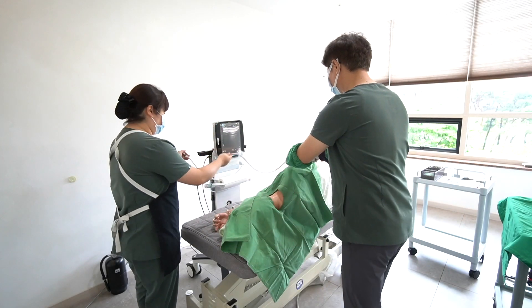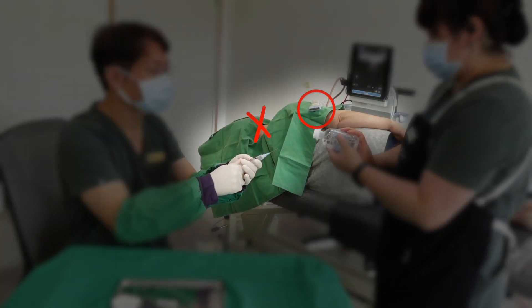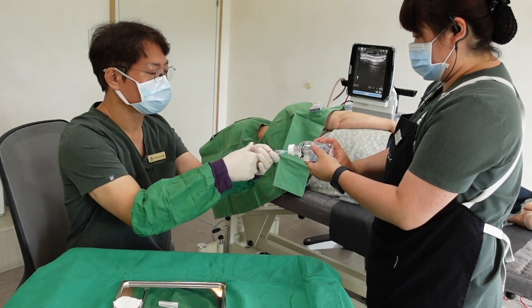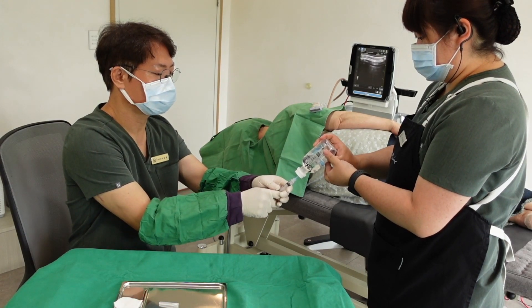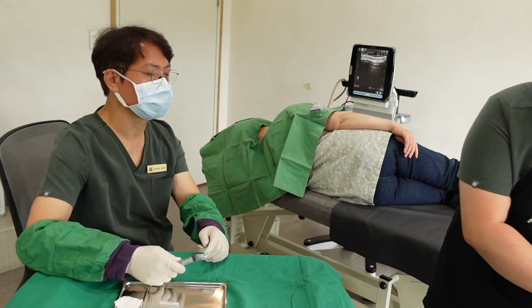Put the probe on the arm, not on the head or neck. Minor careless conduct makes the patient's experience unpleasant. I draw fluid to make a 2ml total volume to apply 1ml in each facet joint.